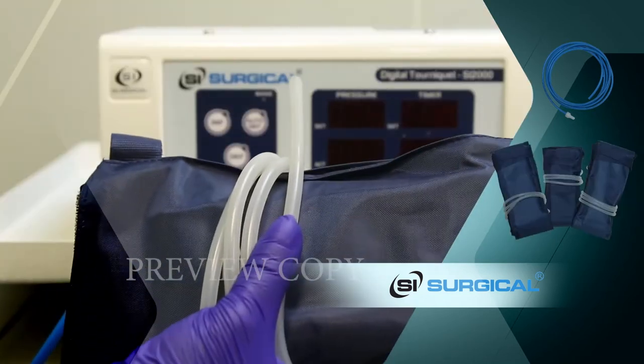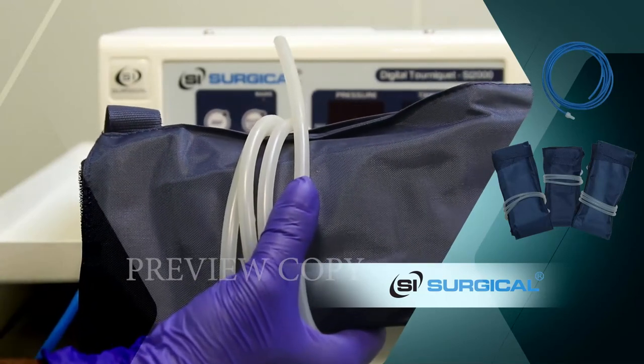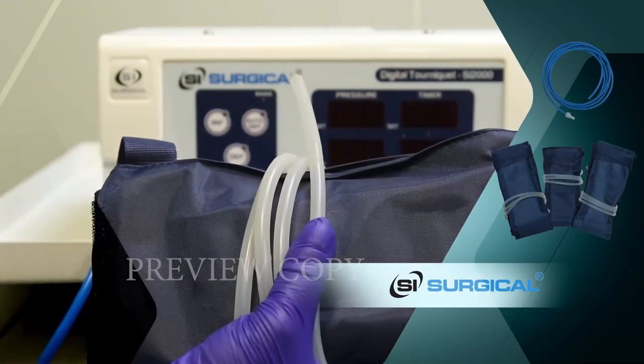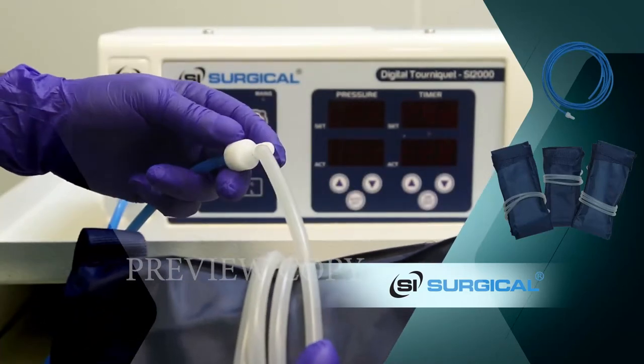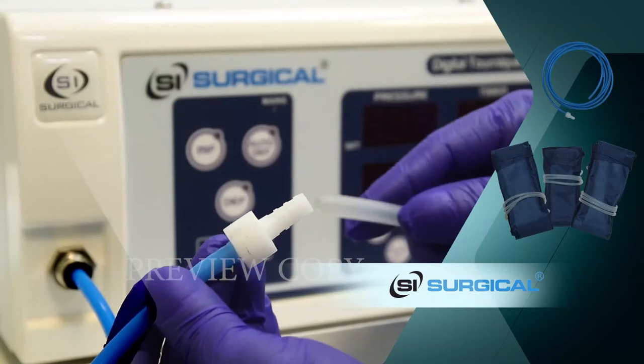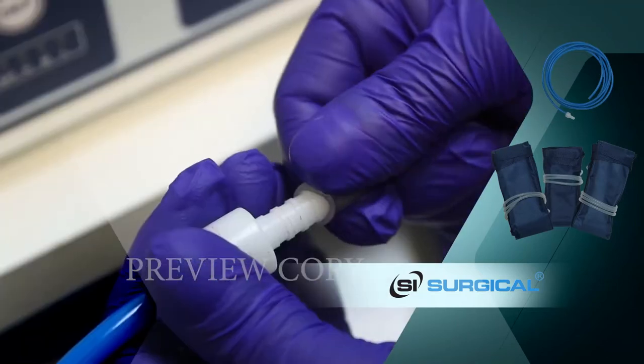This is the cuff. There are five types of cuffs which are available. This end is connected to the cuff like this. We push the pipes together to secure the hose.